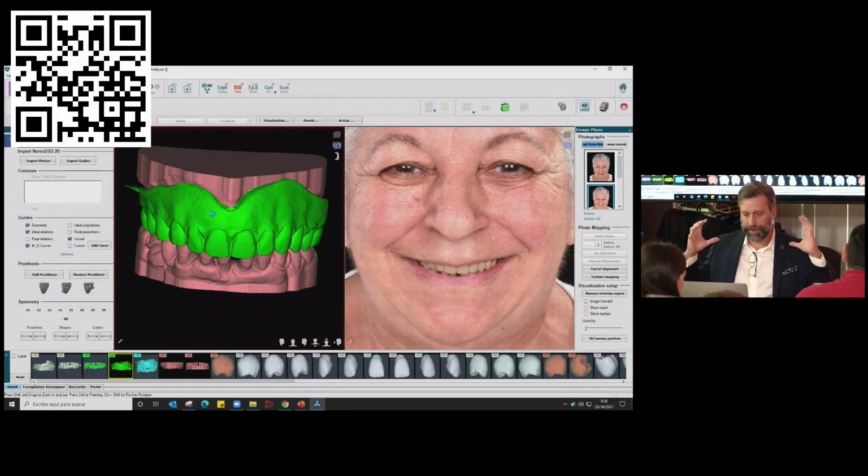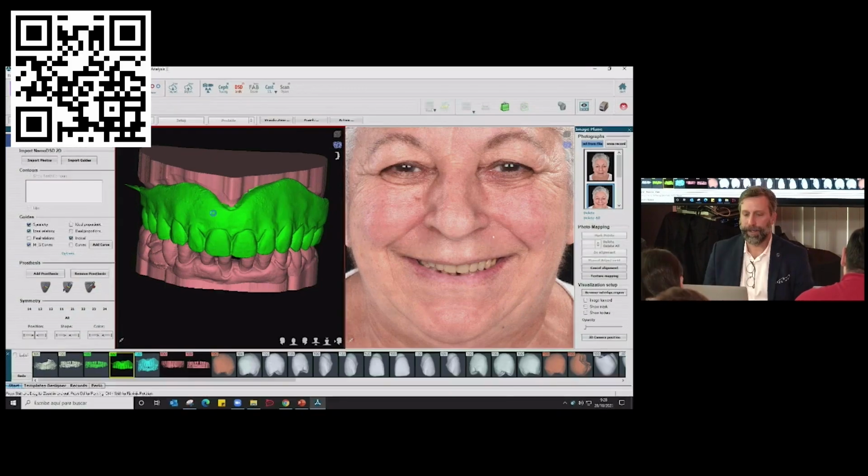So make the CBCT with the denture in place. With retractors? Would be perfect. The retractors are something new that we are recommending to separate the cheek, but less important if you are doing the double CT scan. Okay, but still, I would do it as a protocol for all the patients. CBCT with retractors. Okay, and then scan only the denture. So you place the denture over the support of the chin, and you scan only the denture. The CBCT, only of the denture. So then when you place both things on the software, it automatically aligns both, poof, in a very precise way.